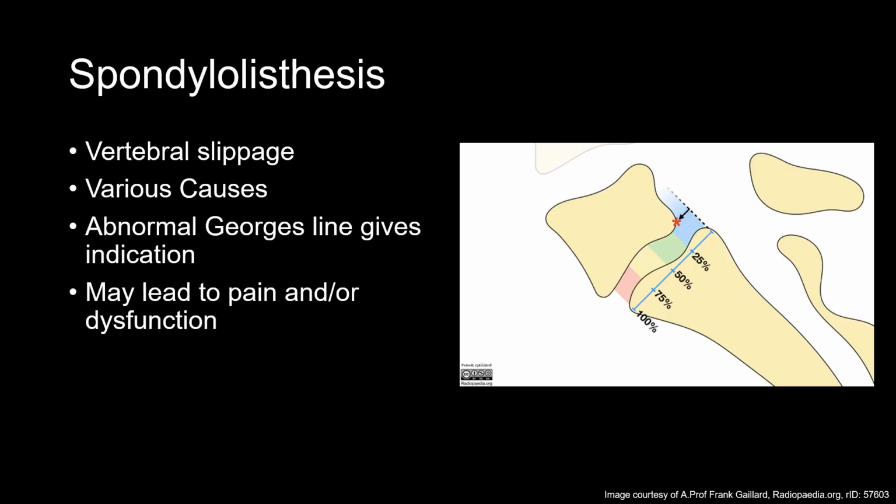So spondylolisthesis, this is again showing that Meyerding's method. We've got the 4 zones, and it just kind of helps you determine how severe it is. And then with spondylolisthesis, you can have either an anterolisthesis or a retrolisthesis. Antero is like what's depicted in this image. Retro would be posterior migration of a vertebral body over the one below.